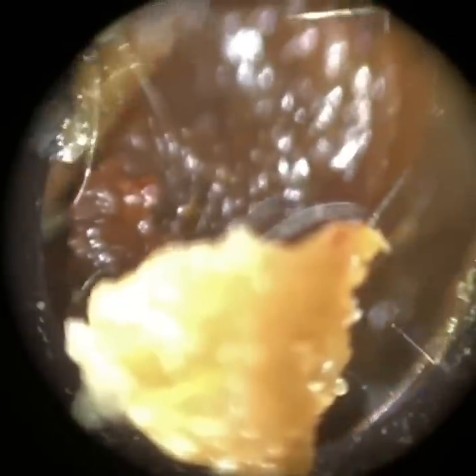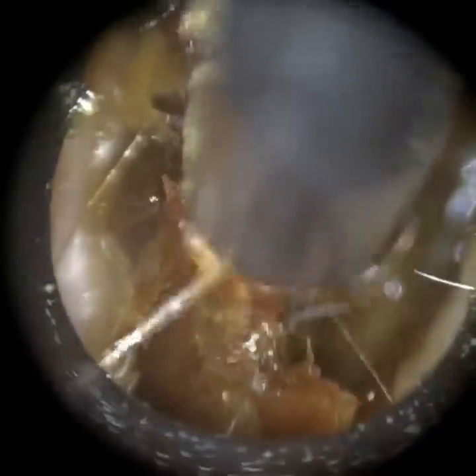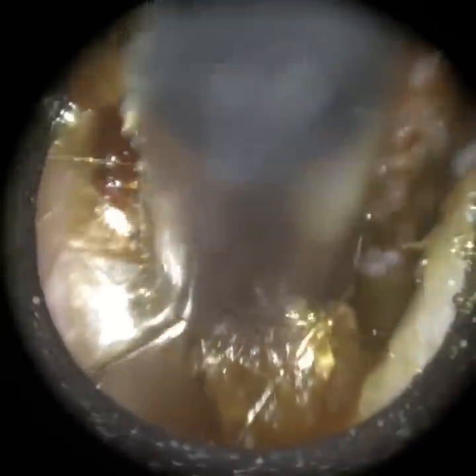I'm using our standard size speculae here, which is a 4.25mm. We have a smaller one, which is a 3.5mm. You can't really go smaller than that because, although there are speculae smaller in diameter than 3.5mm, they're not designed for instrumentation — they're designed just for visualisation. If you go smaller than 3.5mm, you're really going to struggle to insert the instrument and manipulate it to remove earwax.